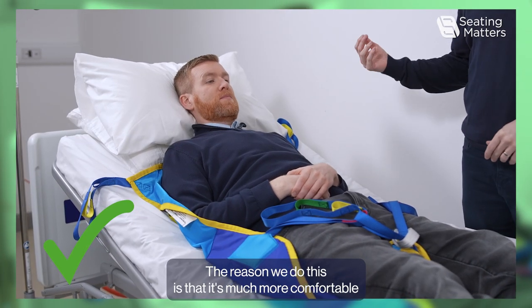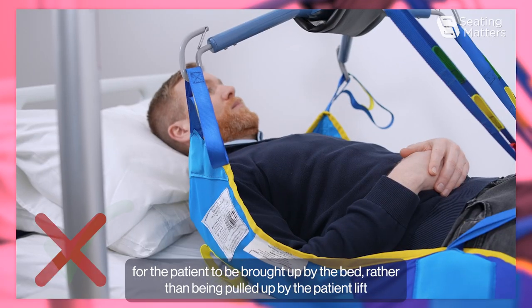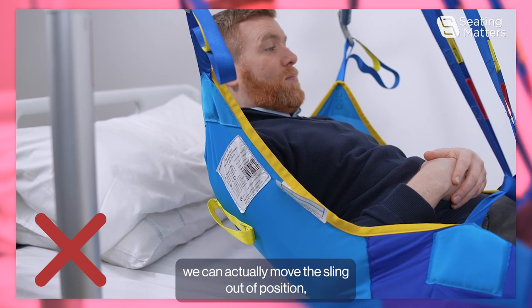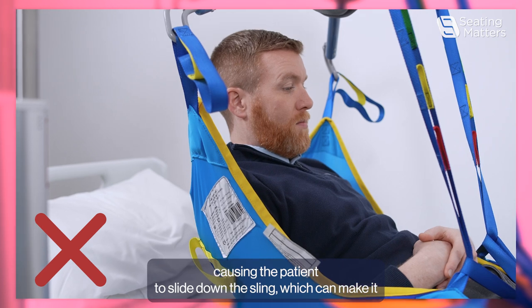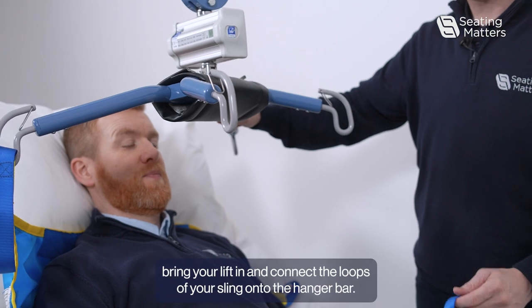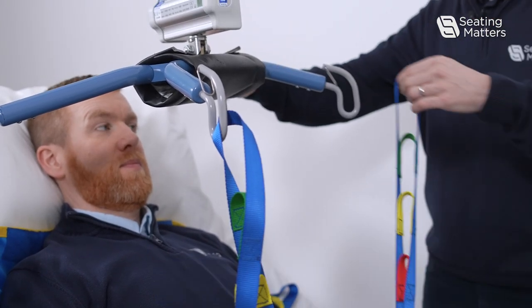The reason we do this is that it's much more comfortable for the patient to be brought up by the bed rather than being pulled up by the patient lift. When we pull the patient up from flat with the lift, we can actually move the sling out of position, causing the patient to slide down the sling, which can make it much harder to get that good position in the chair. Once you have the back of the bed raised, you can then bring your lift in and connect the loops of your sling onto the hanger bar.